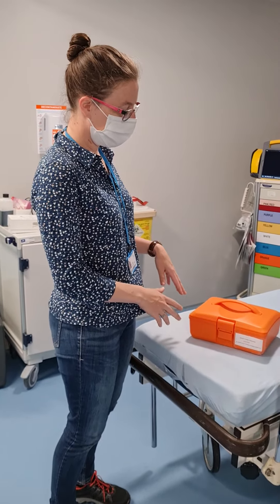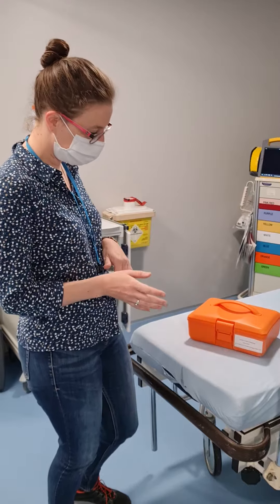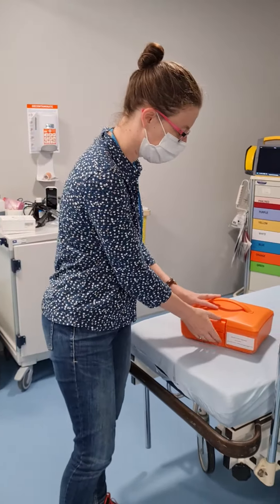So this is our ketone box, which is held in the paediatric DKA drawer, which is in the clinical room in Pete. I'll show you a photo of where that is.